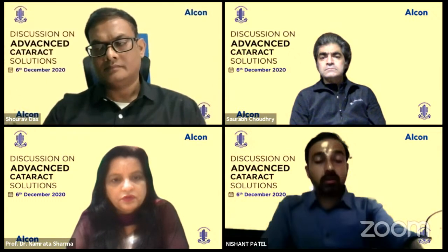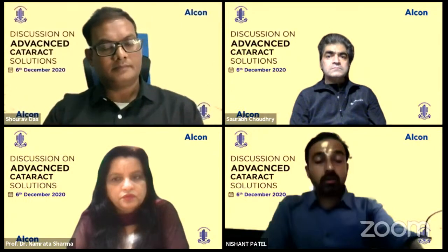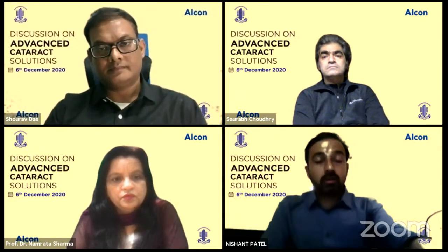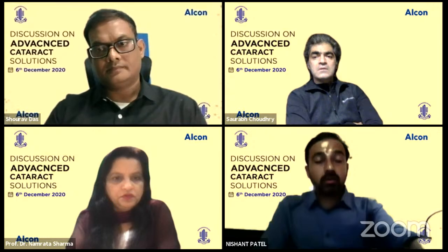Dr. Gopal, Namrata, yeah, can add. See, the main advantage of the advanced tip is that in the Alcon machine the movement is horizontal. That is torsional phaco. Whereas with other companies, the non-traditional or more recent phaco systems, the mechanism is entirely different. Basically it is a modified Kelman tip with the advanced modification. So even though they can attach this, they may not get the maximum efficiency out of it, unless you have software similar to the Centurion with torsional phaco. So that's the main reason.